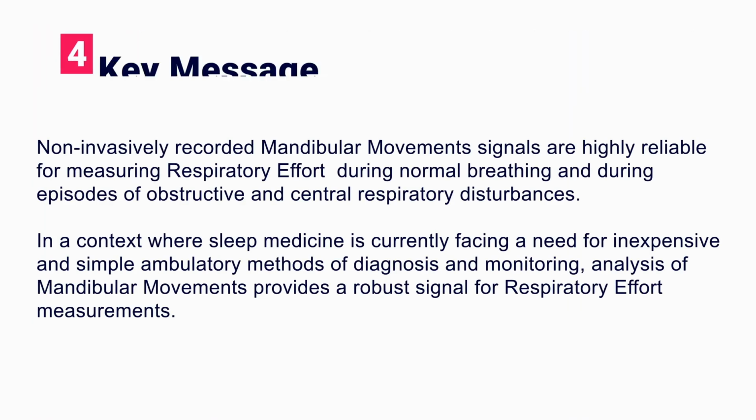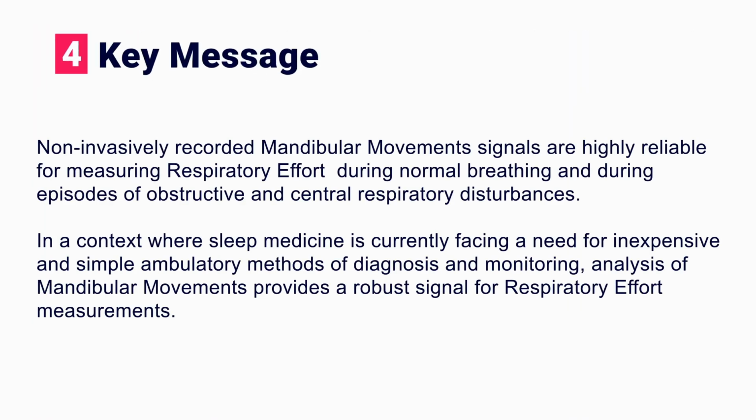Non-invasively recorded mandibular movement signals are highly reliable for measuring respiratory effort during normal breathing and during episodes of obstructive and central respiratory disturbances. In a context where sleep medicine is currently facing a need for inexpensive and simple ambulatory methods of diagnosis and monitoring, the analysis of mandibular movements provides a robust signal for respiratory effort measurements.